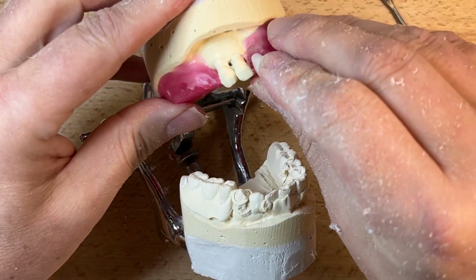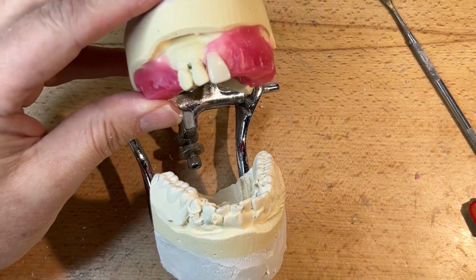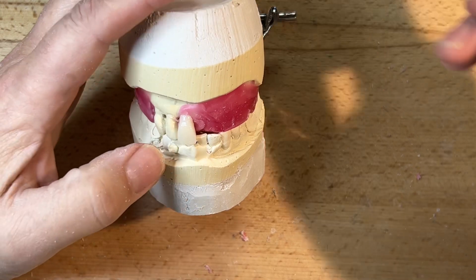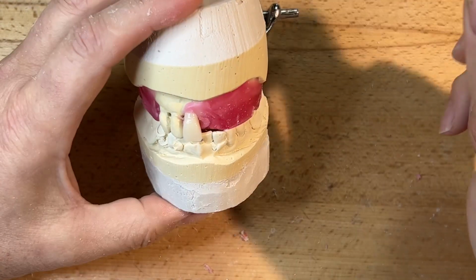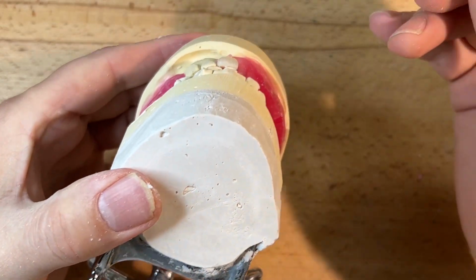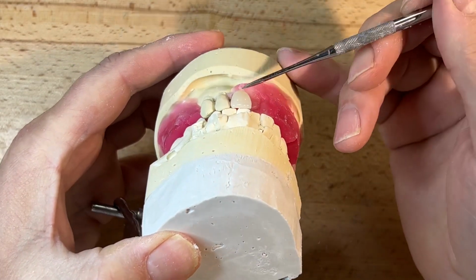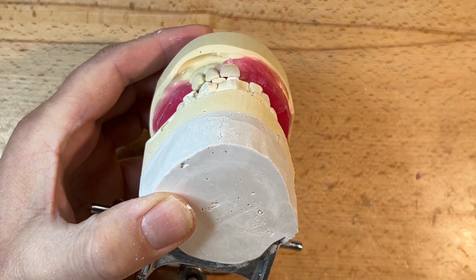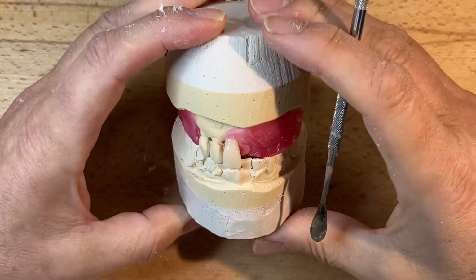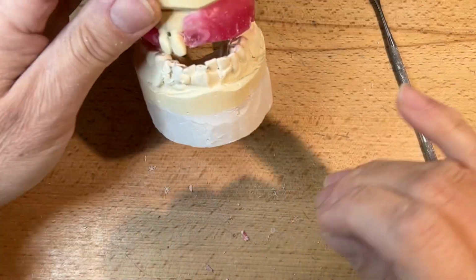And then subsequently, we've got some tissue conditioners for this whole area planned post-extraction, a couple of days, probably about a week after. I remember now, I'm looking at the emergence angle of 2 and 3 and then seeing if my 1 is obtuse to that, meaning a little bit excessive. We don't need to increase any more lip support, nor do we want to increase any kind of boldness in the smile line. I'm going to adjust a little bit more.